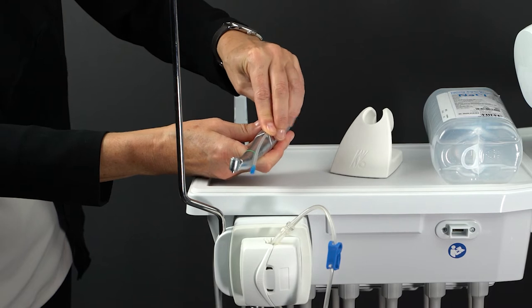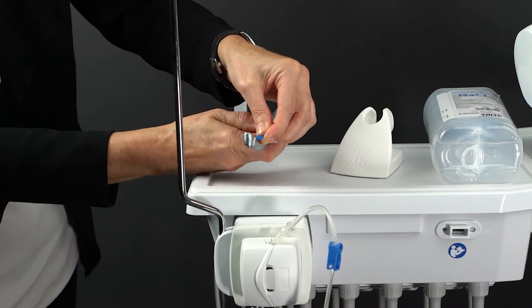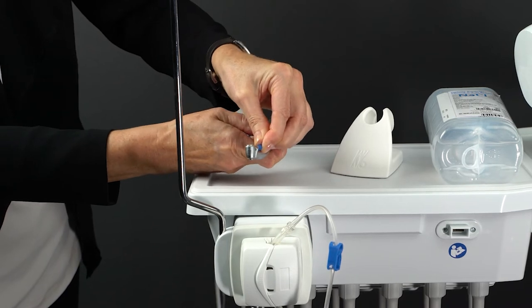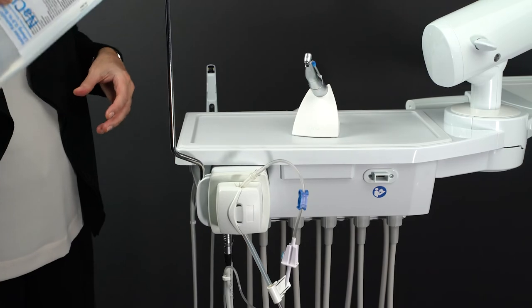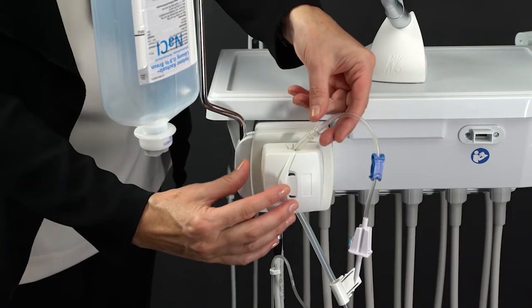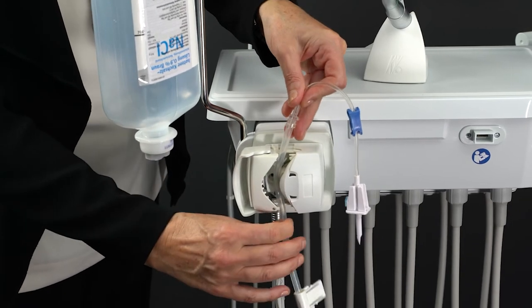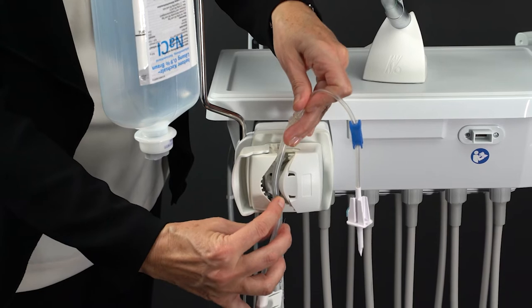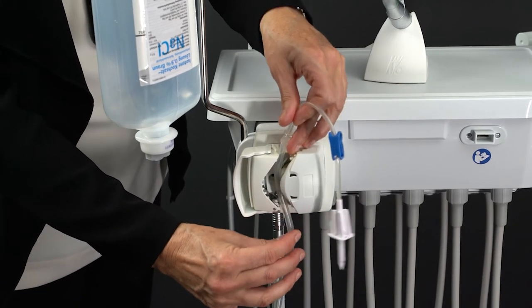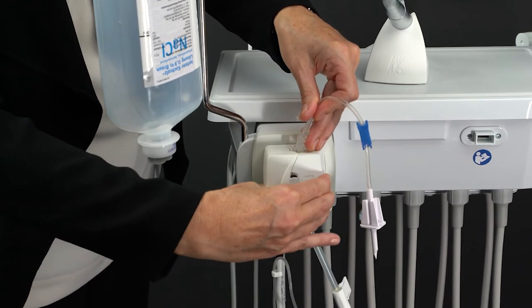The distance from the motor to the first hose clip should be approximately 80 mm. When inserting the hose into the pump, pay close attention to the correct direction of flow. Insert the pump hose so that it is not pinched in the latch.